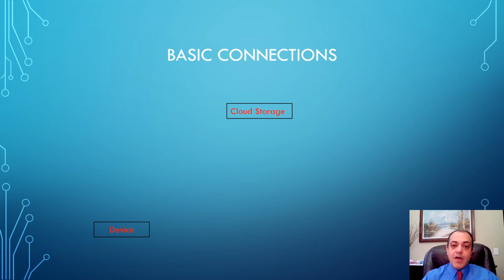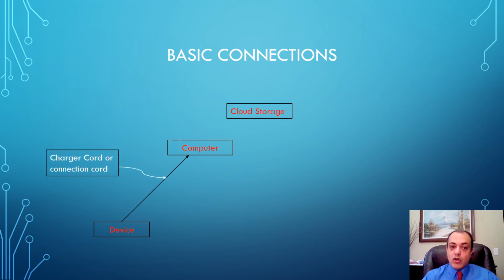To connect from the device to the cloud, you need a computer. So you upload the information from device to computer using the charger cord or a connection cord. From the computer, it uploads to that website and then to the cloud using a driver. What is a driver? It's a piece of software that acts as a translator, if you will, in between your computer and the cloud.